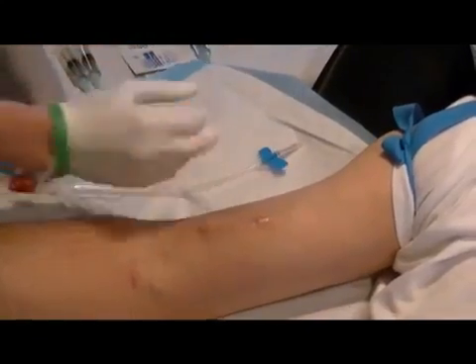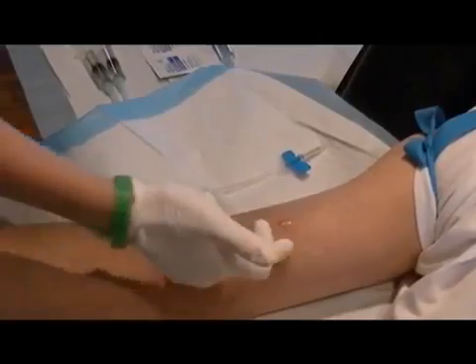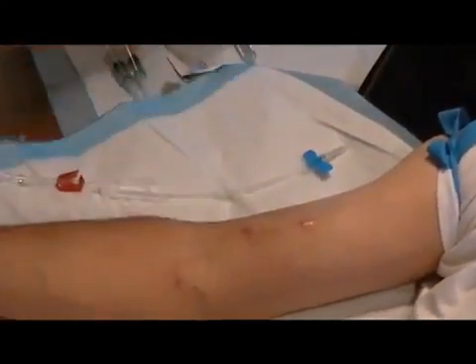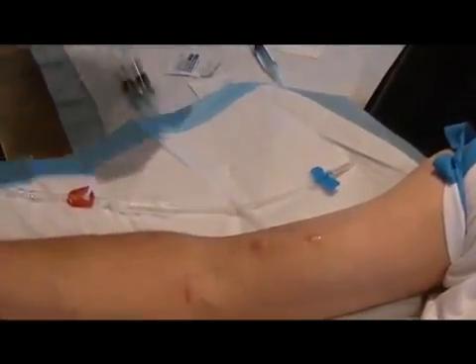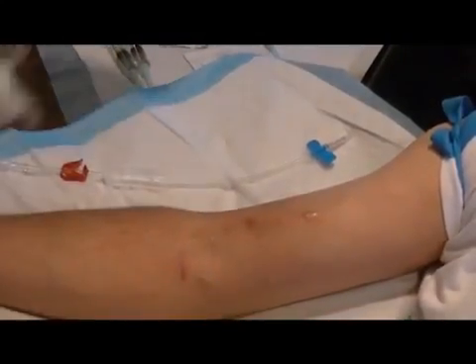We have 2 needles. The red one will actually be the one that's pulling the blood out, and that's the bottom one. The top one is putting the blood back into him. And we'll clean once more here.